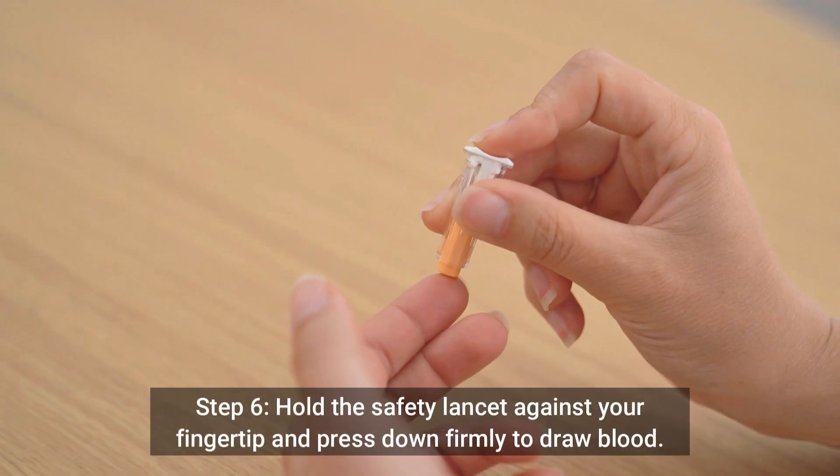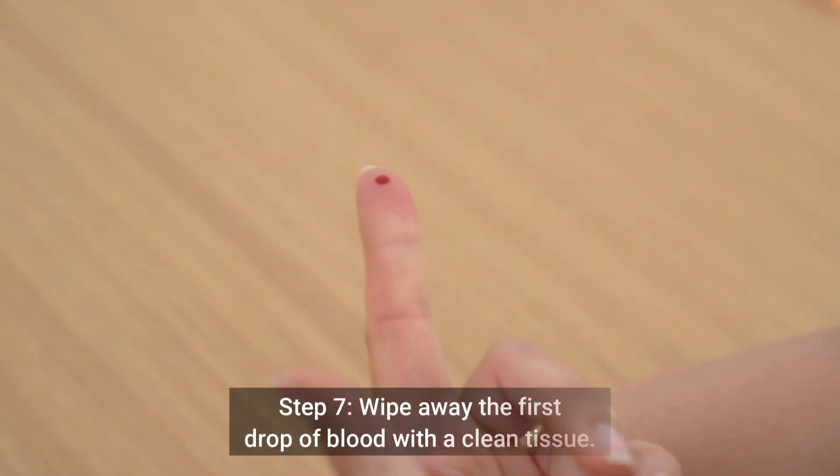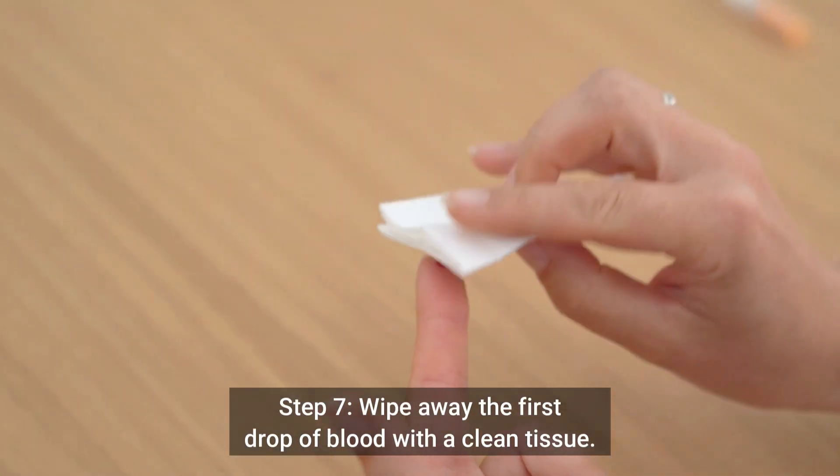Step 6: Hold the safety lancet against your fingertip and press down firmly to draw blood. Step 7: Wipe away the first drop of blood with a clean tissue.